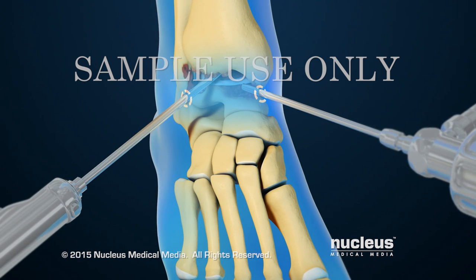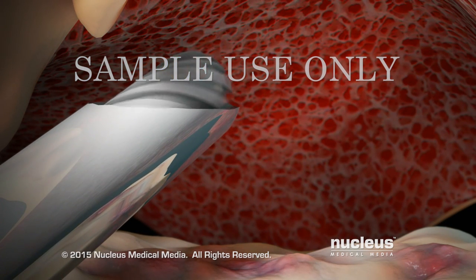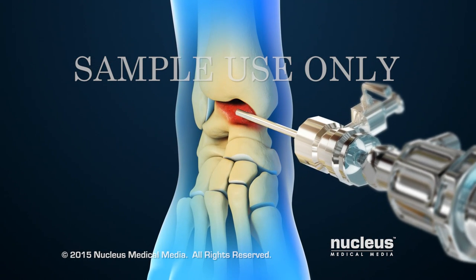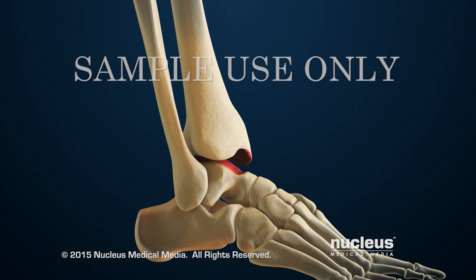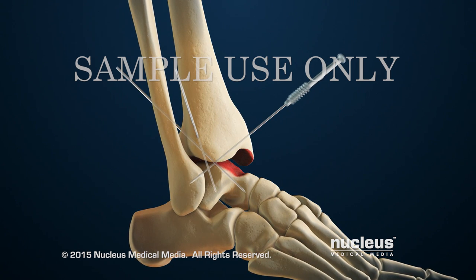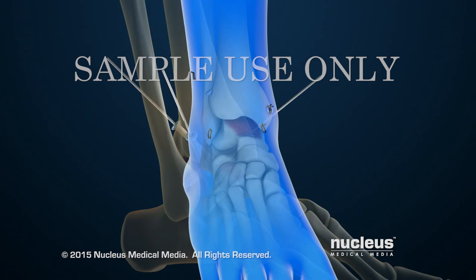The surgeon will use the surgical instruments to remove cartilage and damaged bone from the bottom surface of the tibia. This will also be done to the top surface of the talus. After this, the surgeon will remove the arthroscopic tools and foot straps. Then, two or three metal guide pins will be placed through the bones of the ankle joint, and the surgeon will use the guide pins to place hollow screws which hold the bones in place.